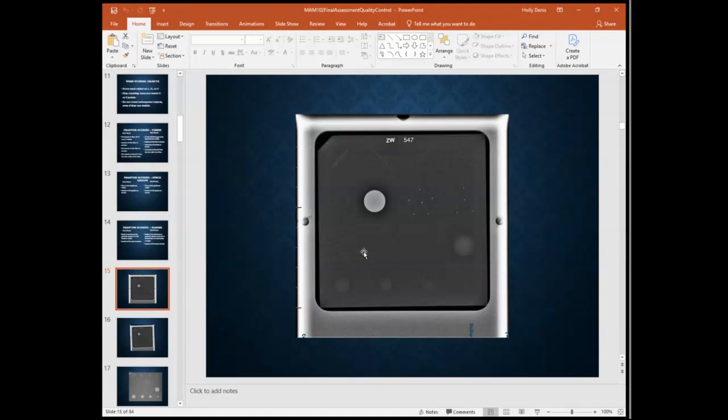1, 2, 3, 4. Which is why we had that discussion board on whether you think one person should do it or whether it should be collaborative for people to do the QC. But from one week to the next, it may look like your equipment is altered if you're seeing something different than me, which you probably are. Did you see the same things that I saw whenever I was going through?